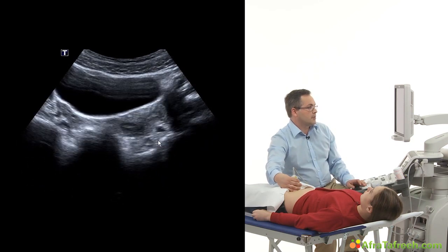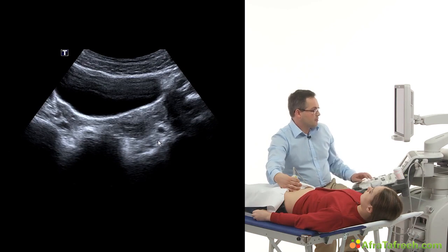Now we managed to find the fallopian tube on the right side, or oviduct, which gives us a hint where we can find the ovary on the right side. We follow the course of the fallopian tube to the location of the ovary here.